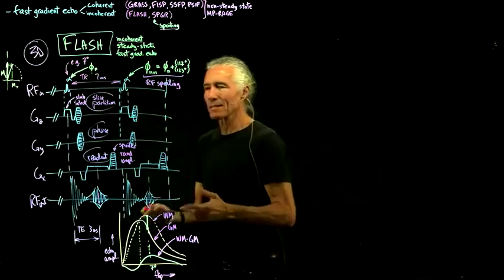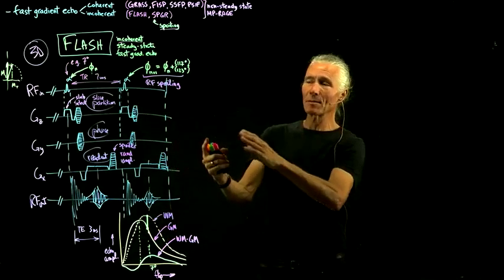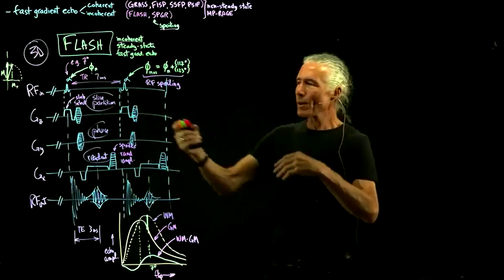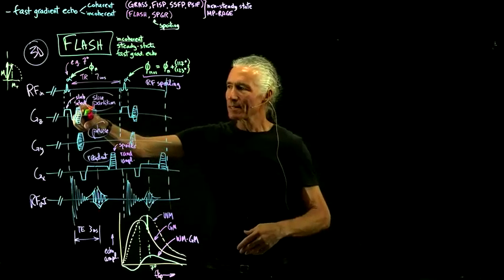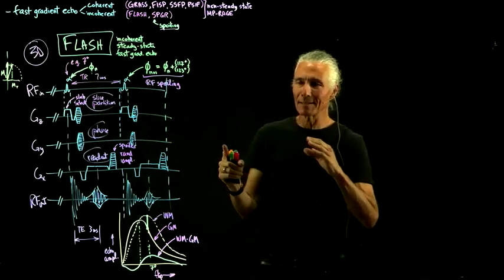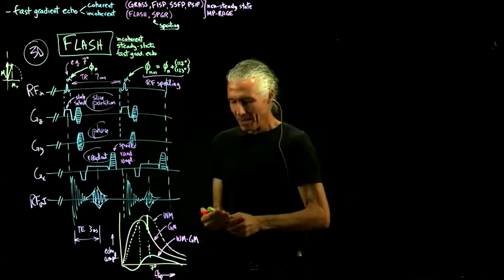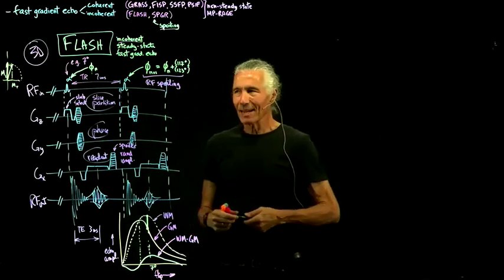So what does this sequence sound like? It just sounds like it's continuously collecting data. You can hear the gradients a little bit as it's stepping through them, and you can hear the gradient getting a little stronger. But the gray-white contrast is not that great.